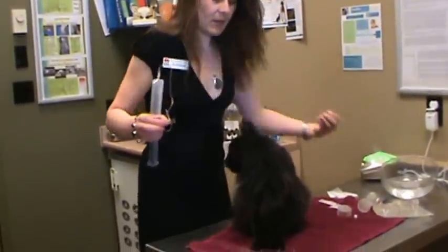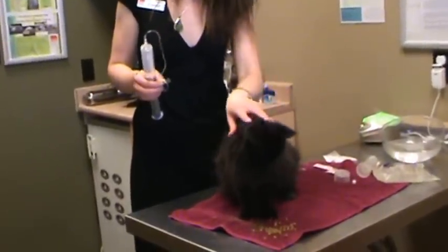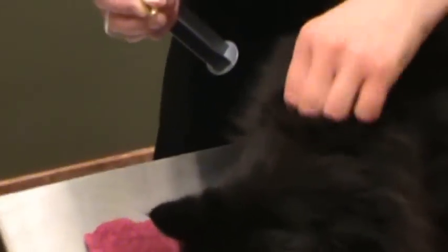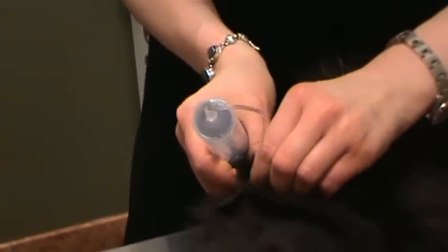Then I gently touch the cat in areas that he enjoys. With Shaka he really likes his head being touched. I take the cap off the butterfly needle and then I basically find a nice little skin tent near his shoulders. I usually go left shoulder, right shoulder, sometimes in the middle. You can also go in the left hip, right hip, and along the sides of the cat as well. But the most easiest is just around the shoulder and the neck. So I just make a skin tent with my non-dominant hand and then put the needle right in under the skin.